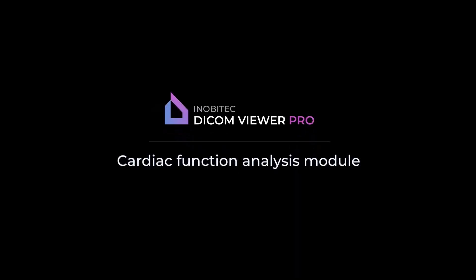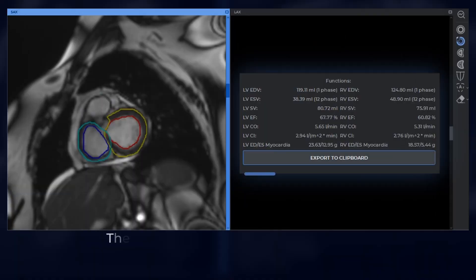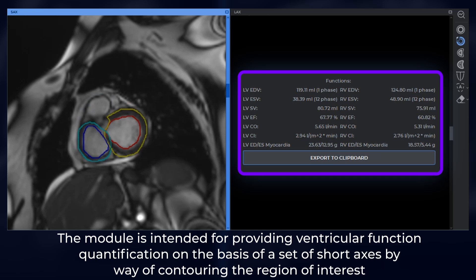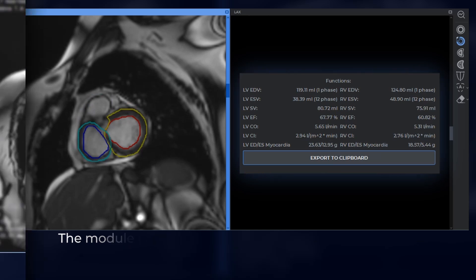Inobitec DICOM Viewer, the Cardiac Function Analysis Additional Module is intended for providing ventricular function quantification on the basis of a set of short axes by way of contouring the region of interest.